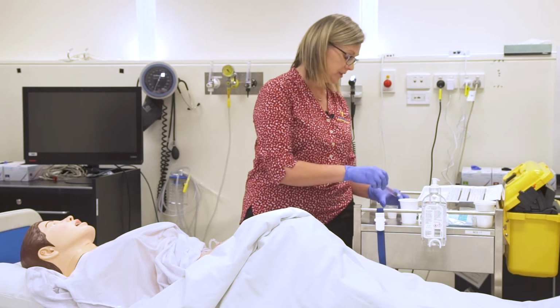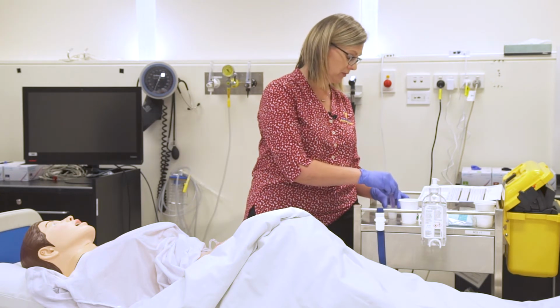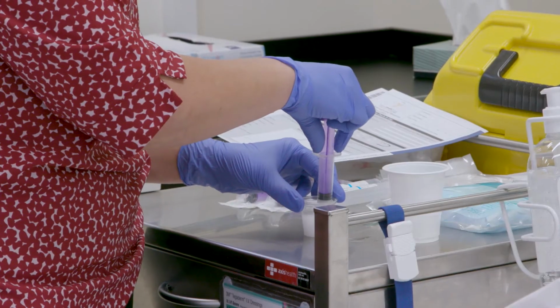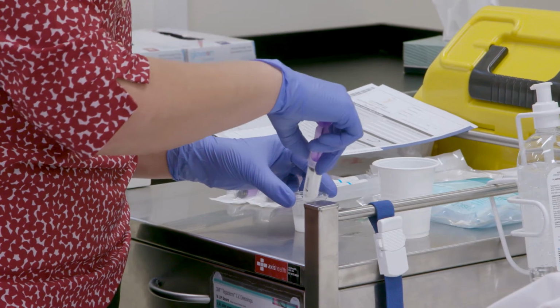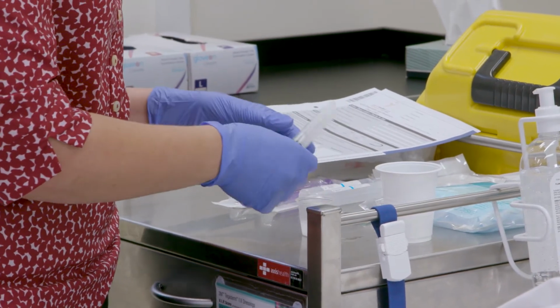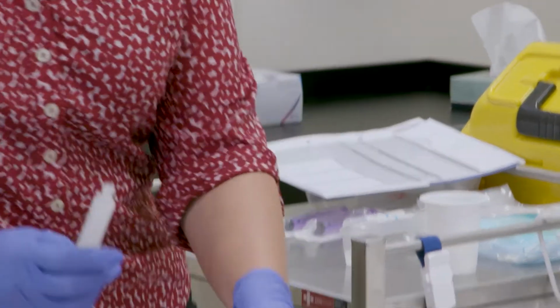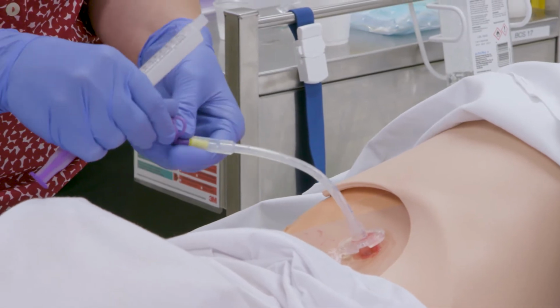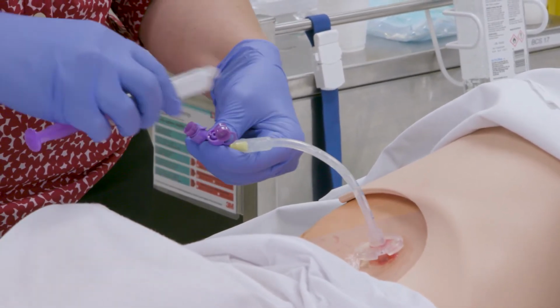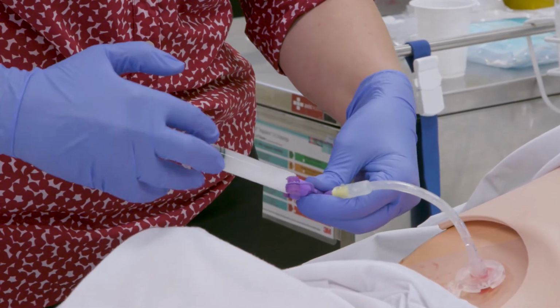Okay. Dissolve your medication, checking your chart, making sure your identifiers are all correct, and administering your medications according to the 7 rights. Okay. Purple syringe to purple tube. Mary, just giving you medication now.